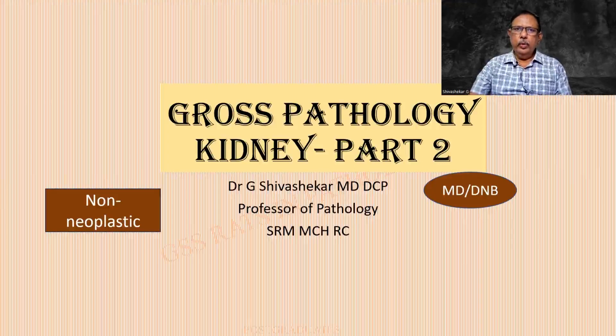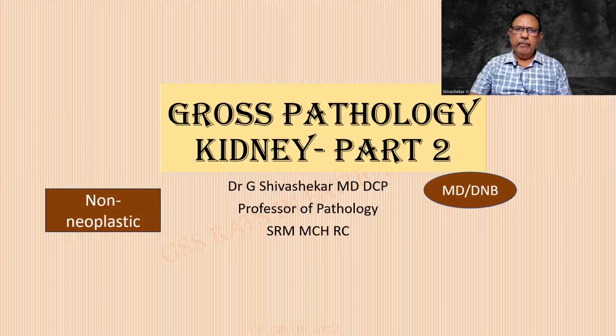I welcome you to the discussion on the gross pathology of the kidney, part 2. This shall be limited to non-neoplastic lesions.